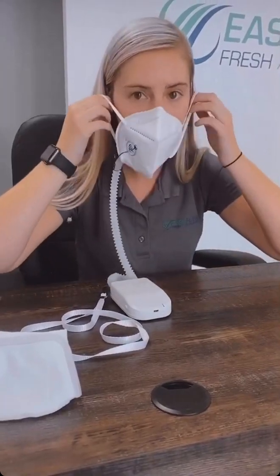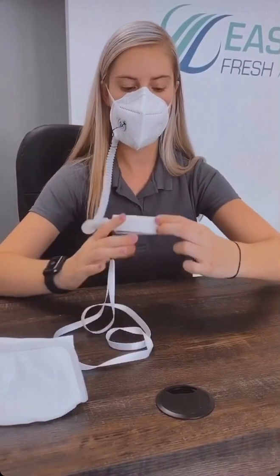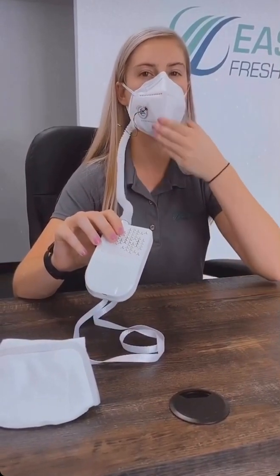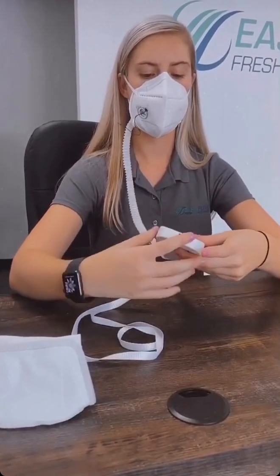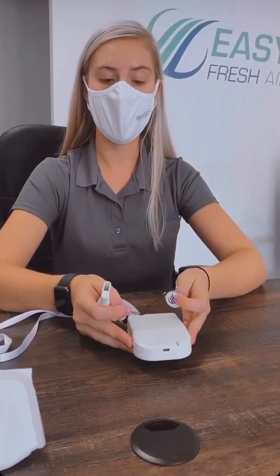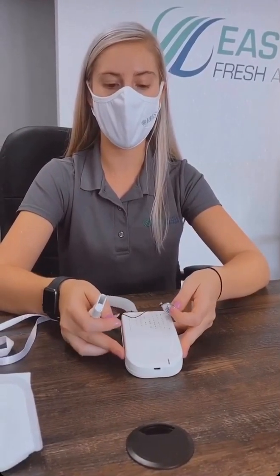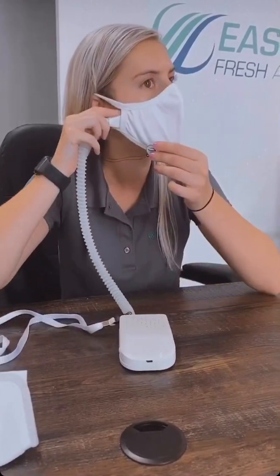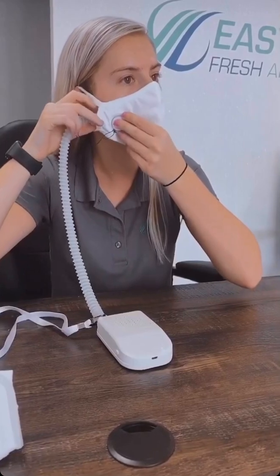Whenever you want to put it on, turn on the device. I can feel fresh air right between my nose and my mouth. Alright, lastly I'm just going to show you how to connect it to the cloth mask. So I'm going to turn my device on, just holding it down for 3 seconds, just slipping it on the side of my mask. There we go.